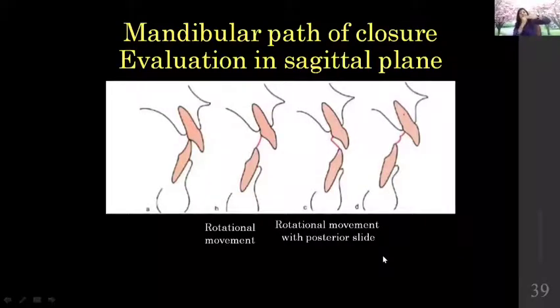In anterior glided class 2 malocclusion, you are seeing something which is worse than what is appearing. Class 2 is more severe in these cases because it is anteriorly gliding. Whereas in a posteriorly gliding mandible, the class 2 is manageable. So in cases where the rotational movement along with the posterior gliding movement is there, you tend to appreciate a good prognosis, right? Good prognosis for the myofunctional appliance.